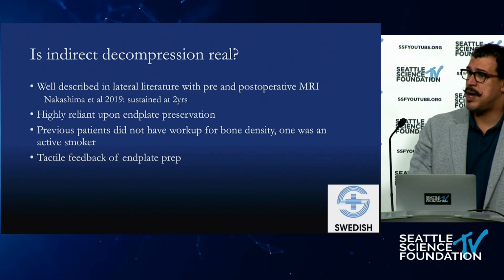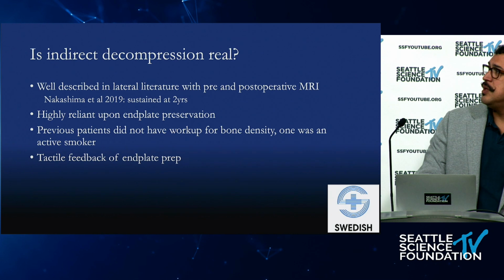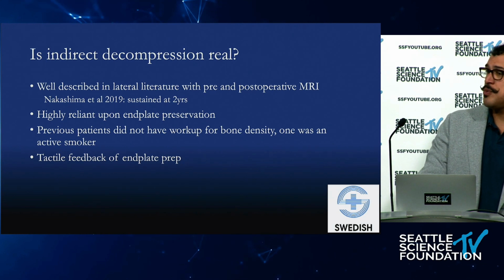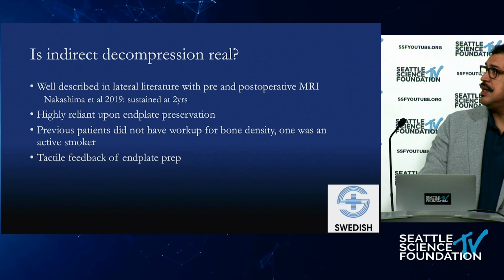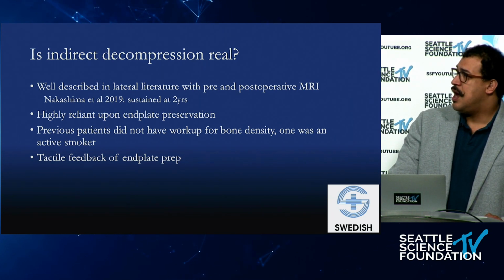Just like Juan was talking about with the lateral, I think that's true for any surgery you do where you're placing an interbody. If you're going to aggressively take down the end plate, you're not going to get the restoration in height. And maybe try for less in a collapsed disc. If you actually get 3 millimeters of height as opposed to trying to put in a cage that's subsided and you're not getting anything, I think that's a huge difference in terms of outcomes.